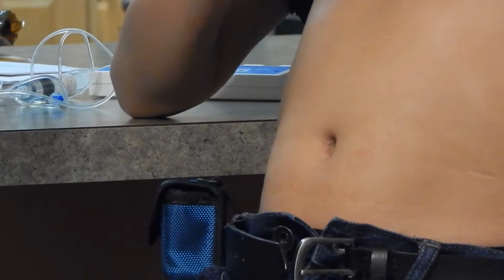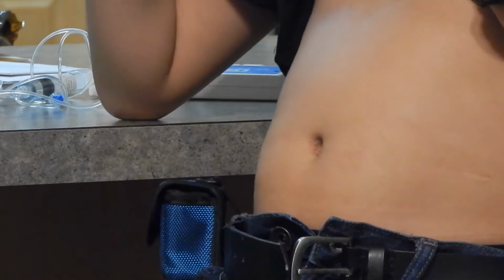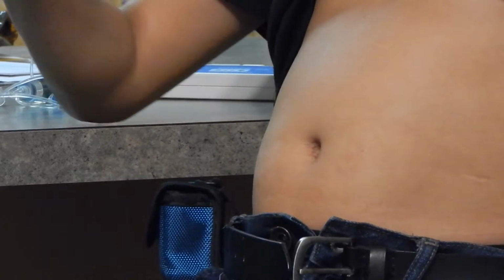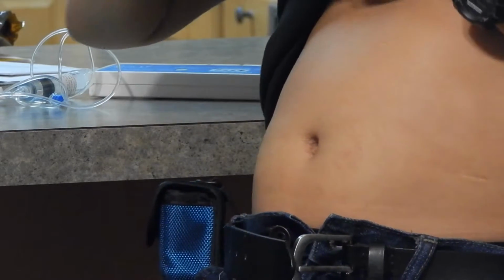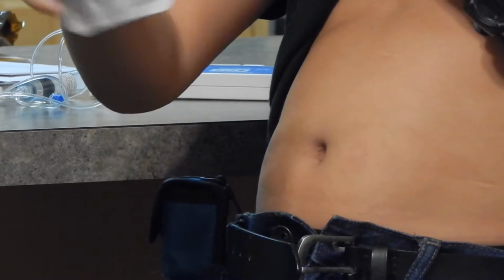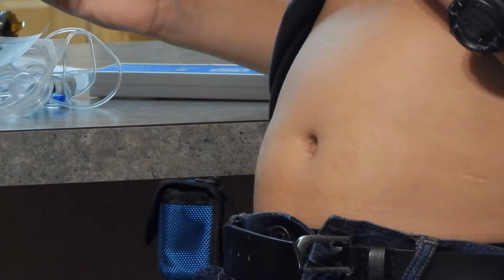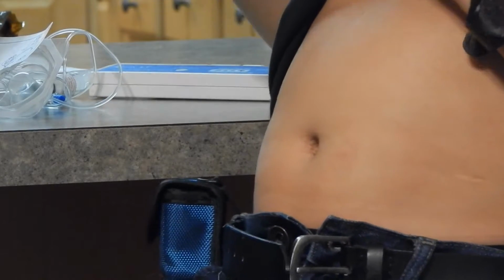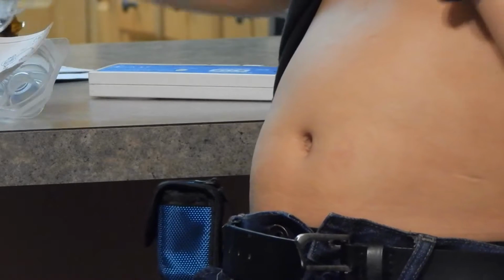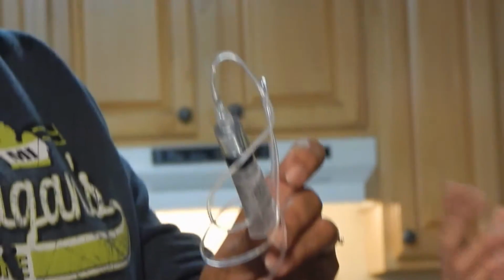This is PTD, and we are going to do a Desferal injection. We're going to show you how to do it. So we are going to need a Medtronic quick set. One of these. You probably can't see it, but it's one of those. We are also going to need a connector to connect the quick set to the syringe, which is with the medication.